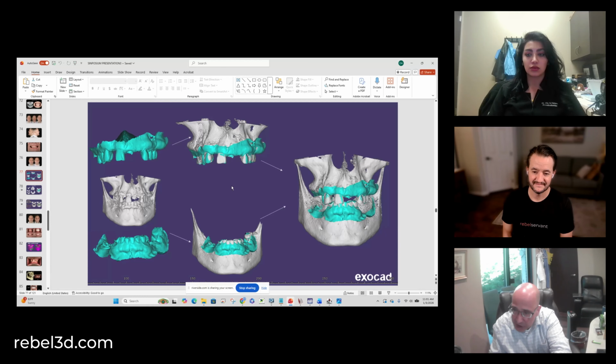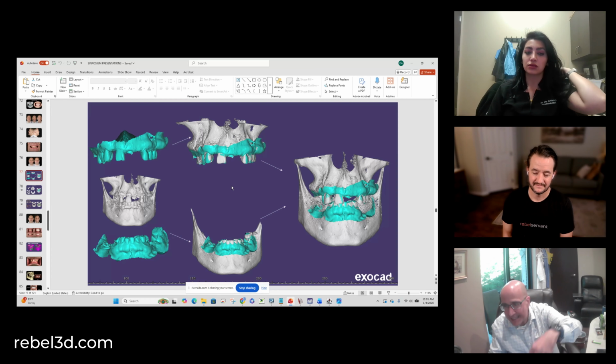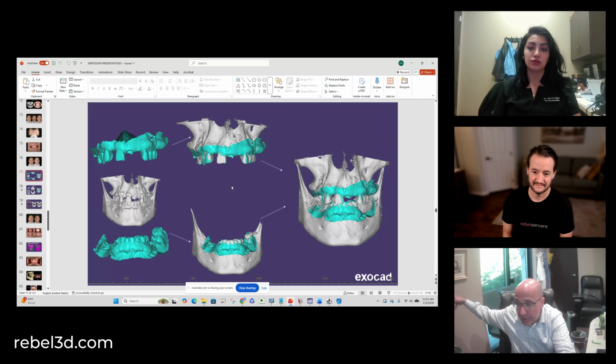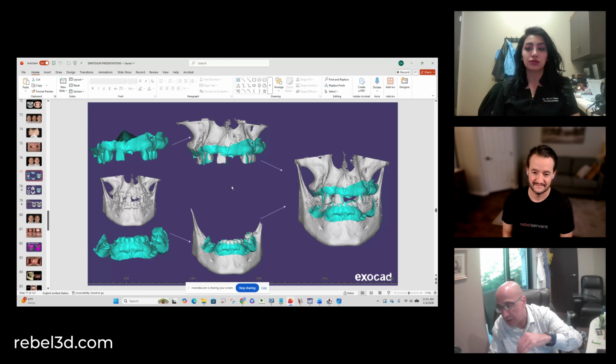Nowadays, the CT scan machines getting into the market are 25 to 35 microns. So using the same technique with nowadays' CT scan machines, which are basically 5 times better than what I had 5 years ago, will make the results even way more superb than before.